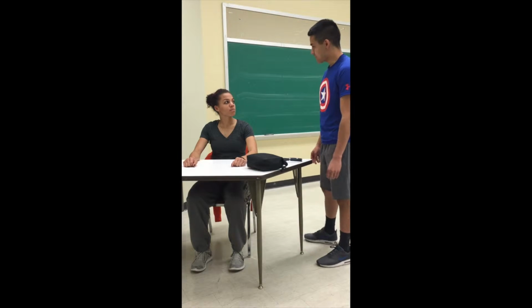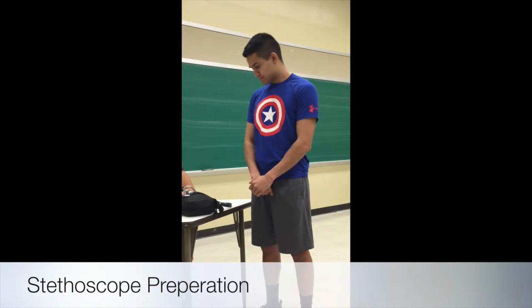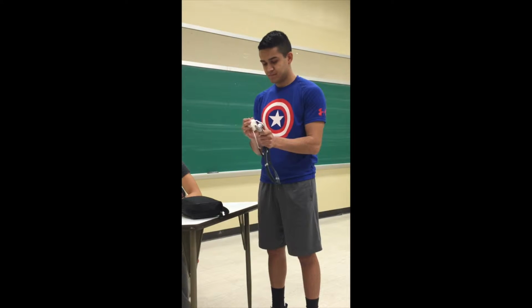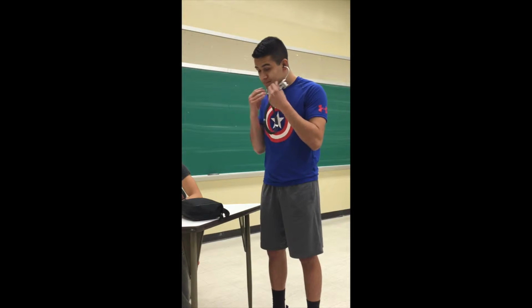Have you smoked or had any coffee within the last 30 minutes? No. Great. Make sure the stethoscope is properly sterilized prior to use. The earpieces should also be facing forward, and the stethoscope should be adjusted so that you can hear the sound. Tap the diaphragm to confirm this.